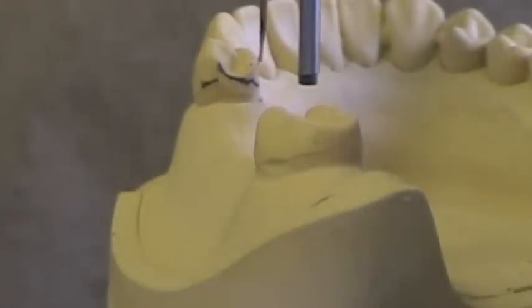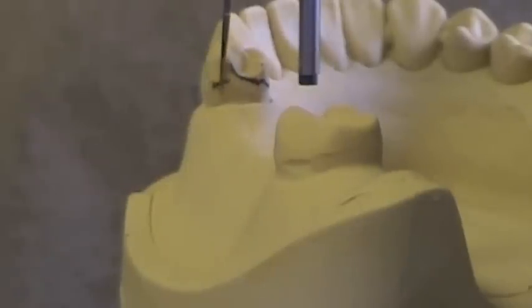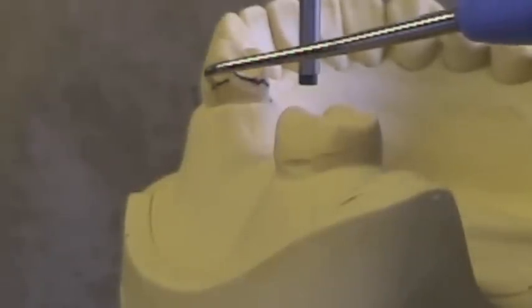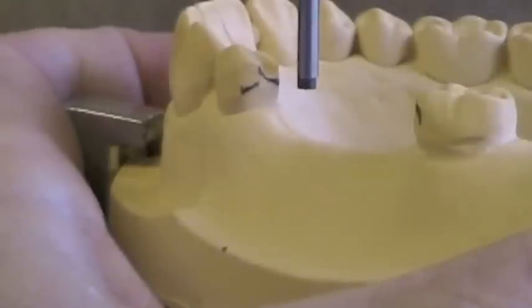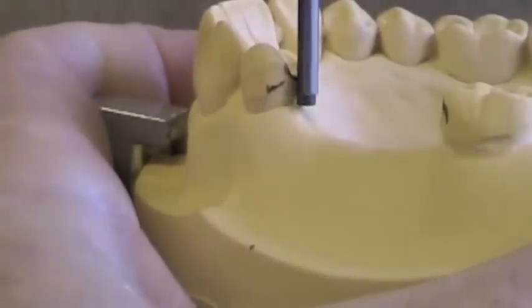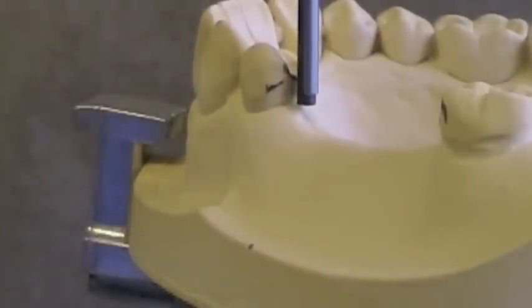Here's a height of contour that's unacceptable. Here's our marginal ridge, and our line is right at the marginal ridge — that means we don't have a guide plane. You can see it stays high all the way around until it spikes at the corner. If you see that your height of contour is at the marginal ridge, you don't have a guide plane. You may either have to change your tilt to see if you can line that up better, or go back and do some adjustments intraorally.